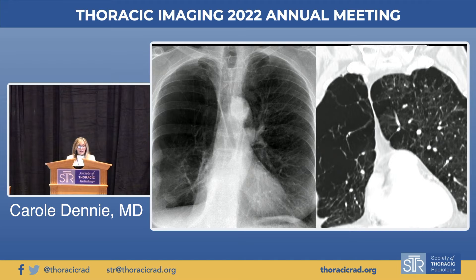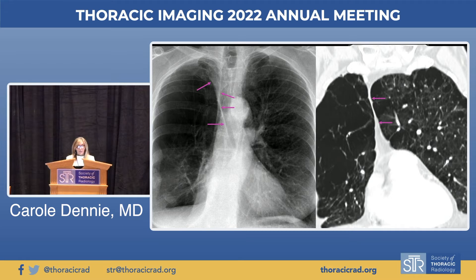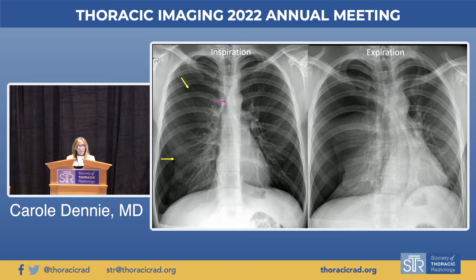The inverted V-shape inferiorly is there because the heart displaces the lungs laterally so it disappears. It can be displaced or distorted — for instance, in a patient with prior right lower lobectomy, the over-expanded left lung pushes it towards the right side due to volume loss on the right. It can also be displaced towards the contralateral side by increased pleural volume, as seen on expiration with increased volume on the right pushing it left.